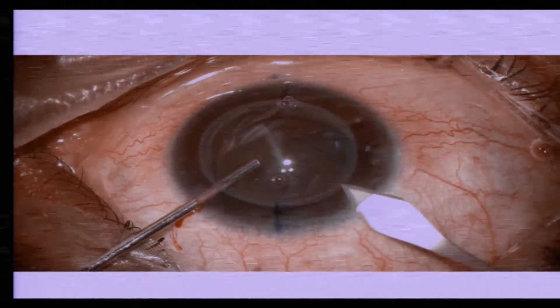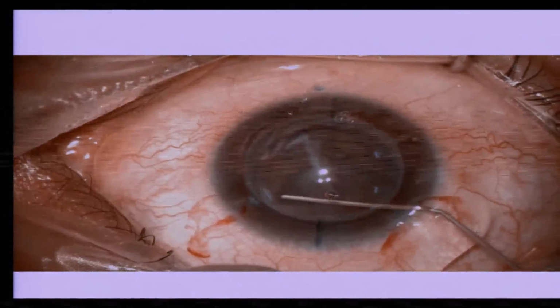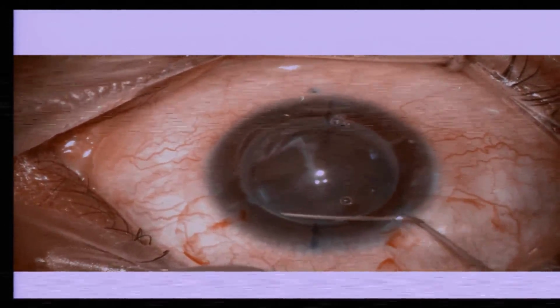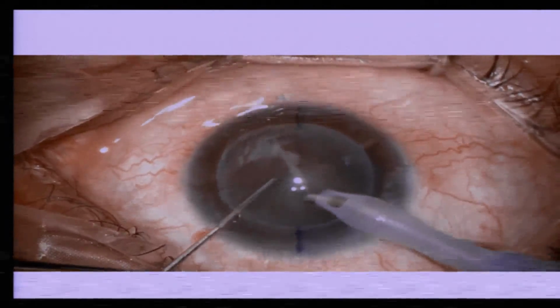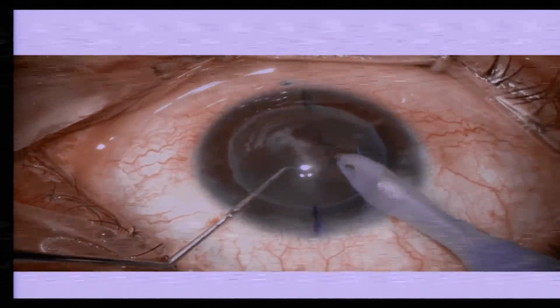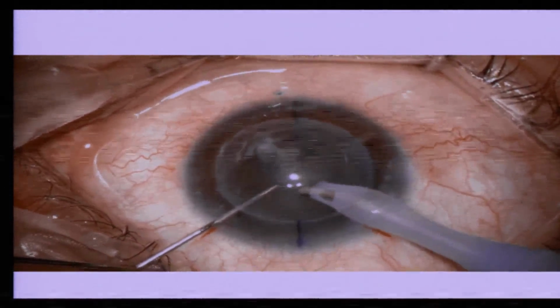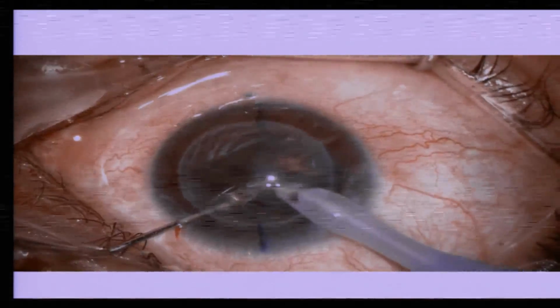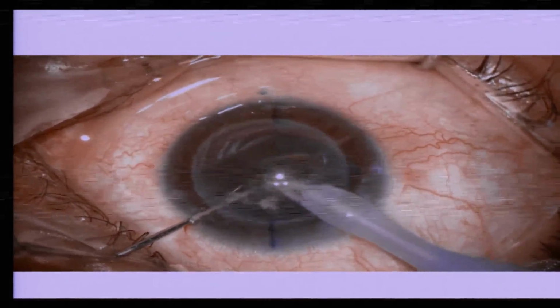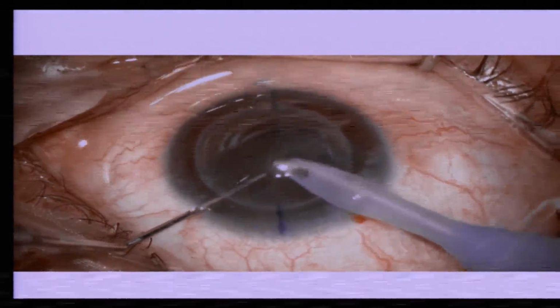In terms of incision, in this surgery, I've done a clear corneal incision, but if you're doing a larger graft, I think you should not have your incision cross the graft-host junction. So you can resort to making a slightly scleral incision, which is better because you can avoid manipulation at the graft-host junction. This is a soft cataract, so we didn't have to use too much phaco power. We were able to use most of the aspiration to aspirate out the cataract.